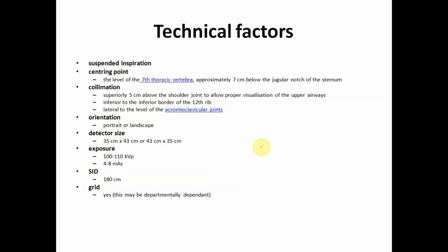Sometimes, if a fracture is suspected, thoracic or any fracture, you don't use a high kVp technique, because we need good contrast of the bone and the soft tissue. In high kVp technique, there is more penetration, and you can't see very good image quality of the bone. That's the reason. If it is a suspected fracture or rib fracture or anything, we can give factors around 50 to 60 kVp, around 10 to 15 mAs.